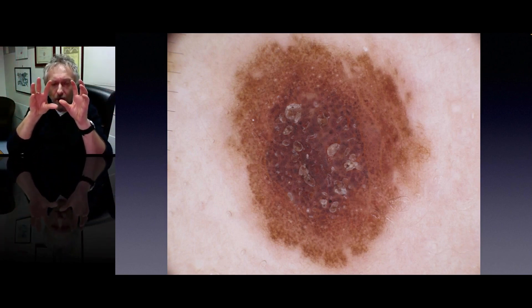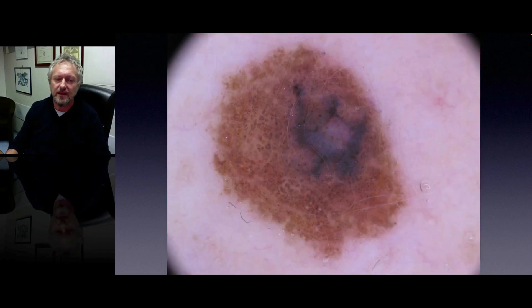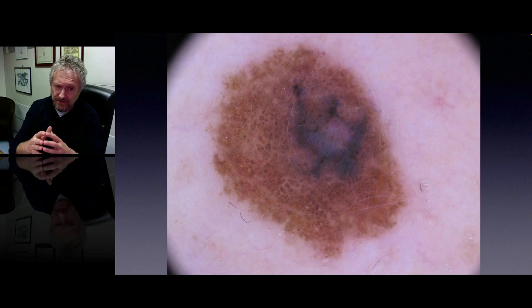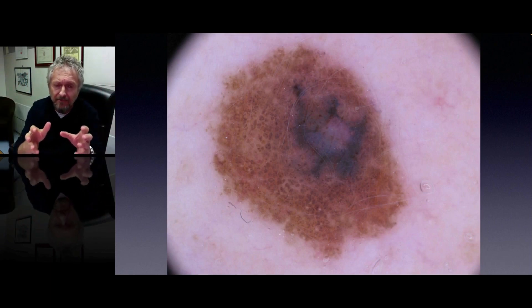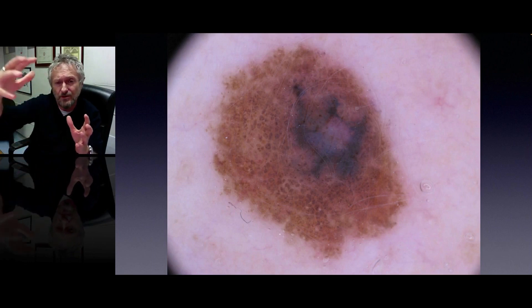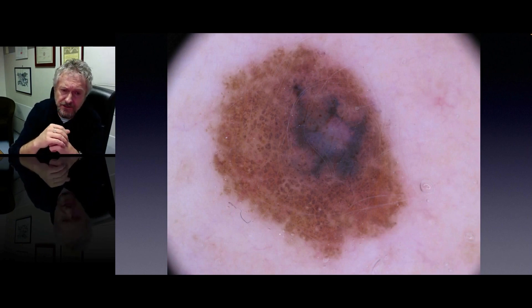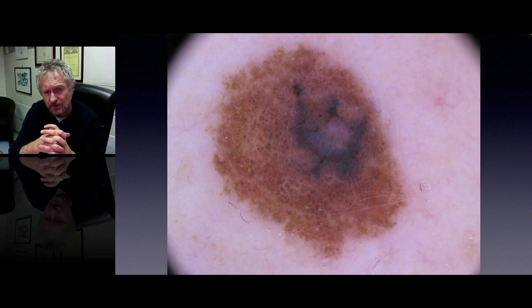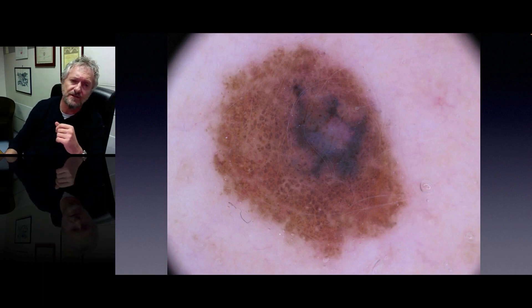Look instead at this lesion, which is showing basically the same structures — this kind of cobblestone pattern — but look how irregular the overall architecture of this lesion is. There is a bluish color on one side of the lesion, so this is definitely a much more worrisome lesion. This is actually a small congenital nevus where a melanoma was arising in between — a melanoma associated with a small congenital pre-existing nevus.